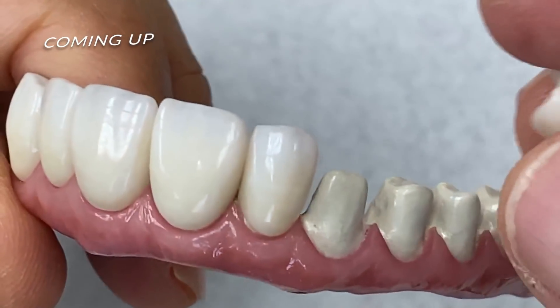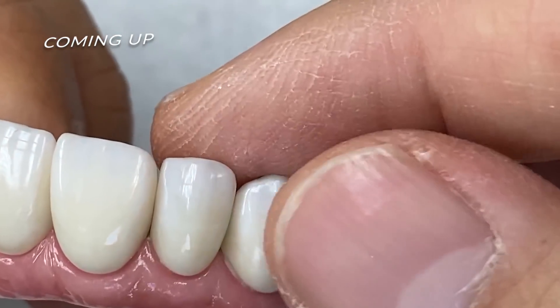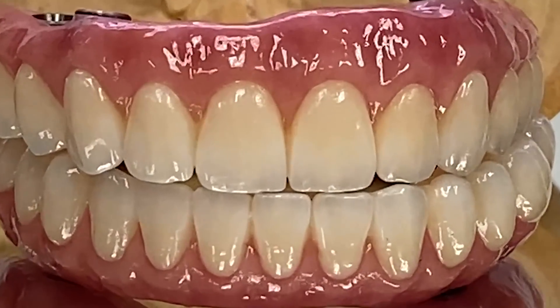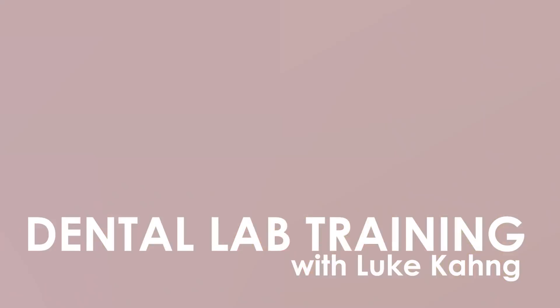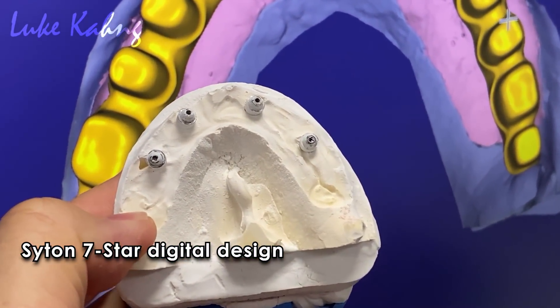This is the top-of-the-line restoration full mouth case. There are four implants with the Syton 7-Star.